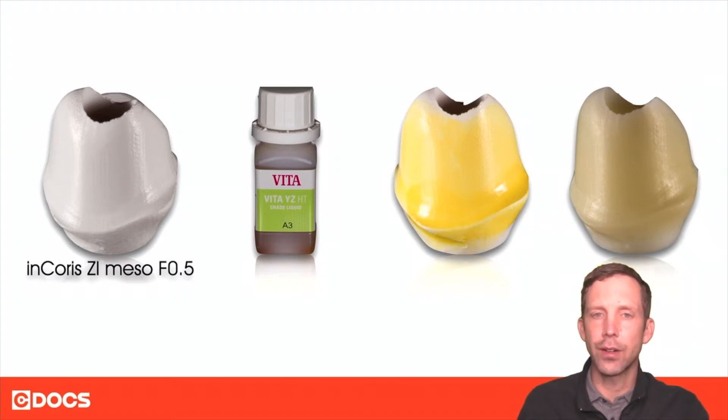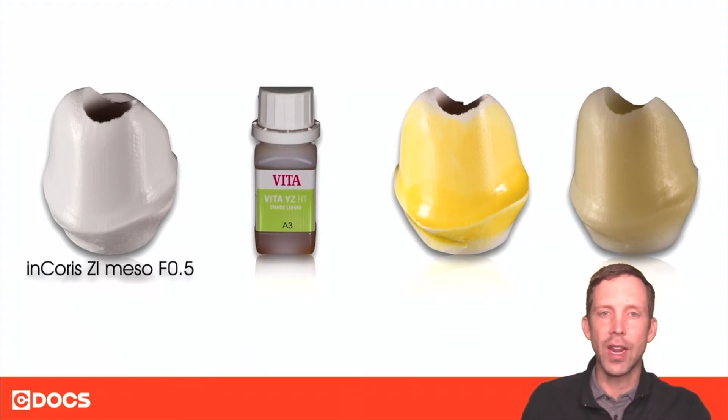The example I'm using here is from Vita — it's a Vita YZ HT liquid in the A3. You paint it on before you sinter the restoration. When it comes out of the sintering program, it's going to change the base shade of that abutment.